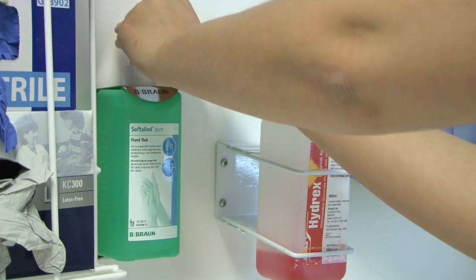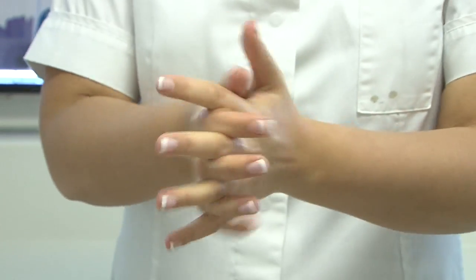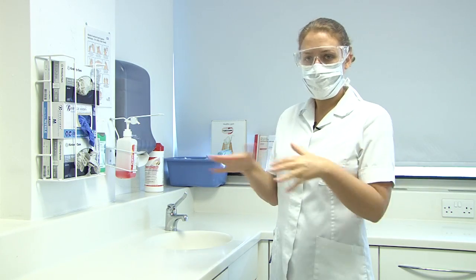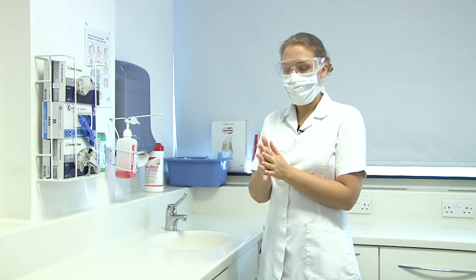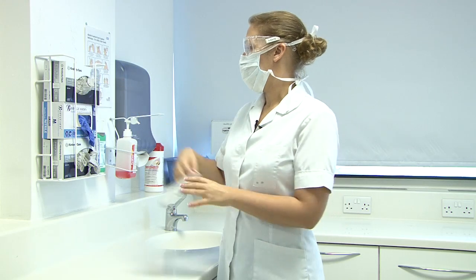And you use the alcohol rub on your hands. Now the alcohol rub takes a little while to dry, so you may see members of staff on clinic waving their hands. Once the alcohol rub is completely dry, select the gloves in your size and place them on.